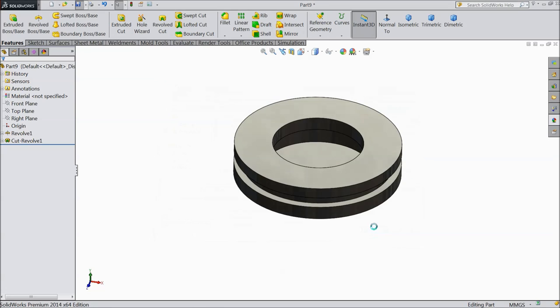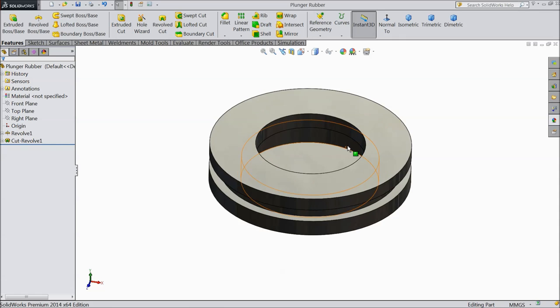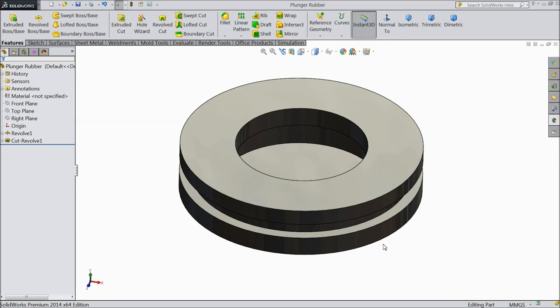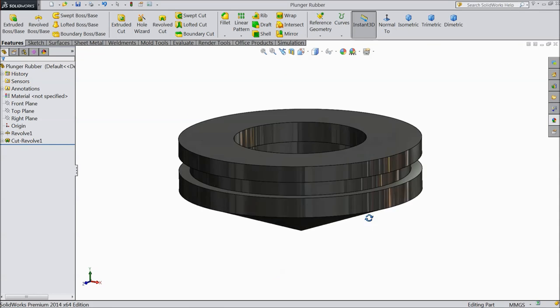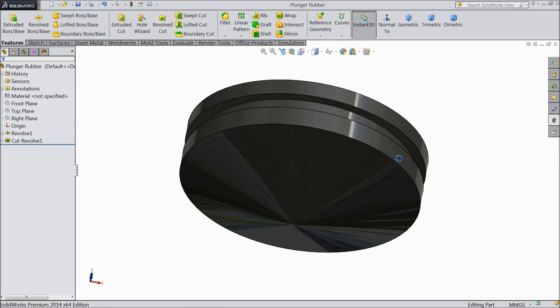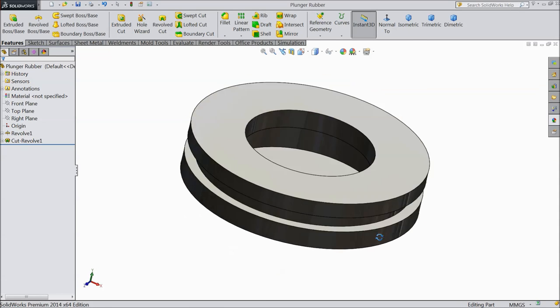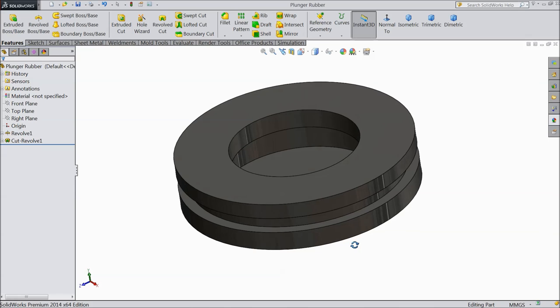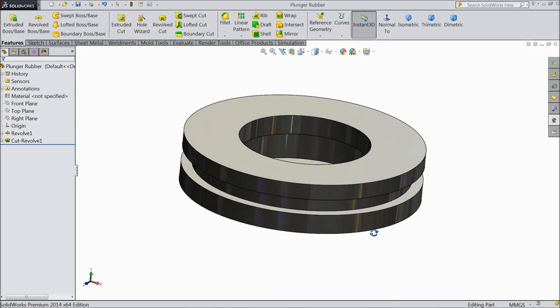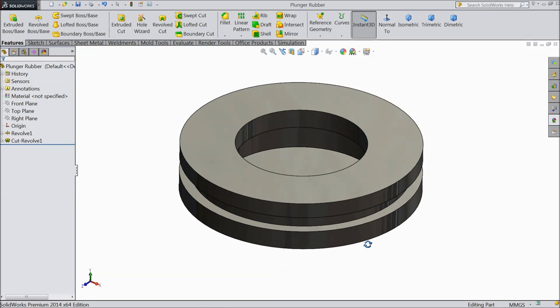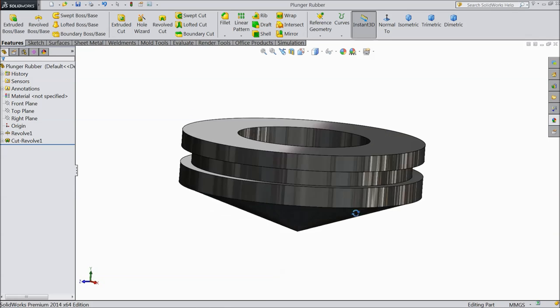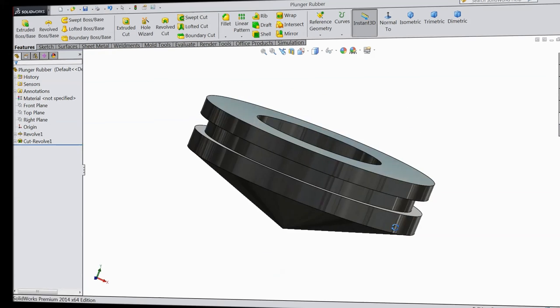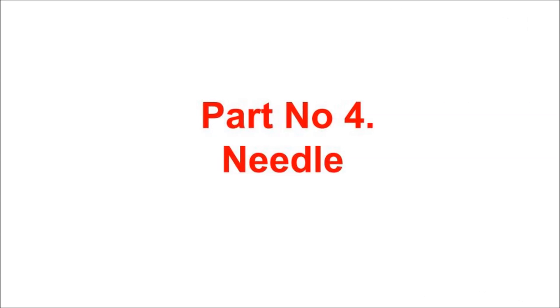Now see — the plunger rubber is ready. This is the plunger rubber for the syringe. Now save as plunger rubber. Now we will move to make the last part — needle and cap.